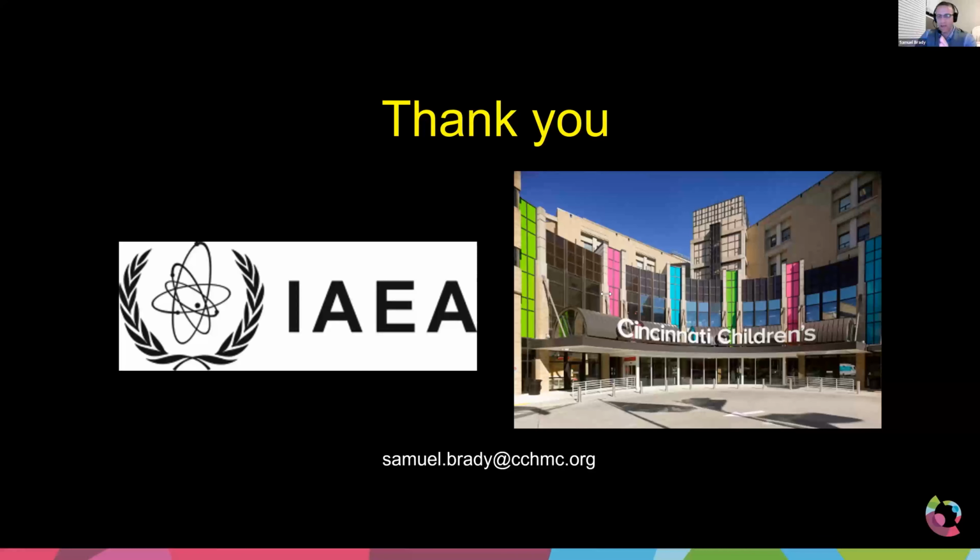And then you'll add whatever kernels you want to it, bone, lung, whatever. For bone, for example, you might want a thinner slice so you get better resolution in the Z-axis. Will the images look maybe a little noisier? Maybe. A 5 millimeter soft tissue and a 5 millimeter bone image, the bone image is probably going to look pretty good, but at 5 millimeters you're getting a lot of averaging. If you cut those thinner, you'll be able to see the detail in the Z-axis more finely, but because they're thinner, they're going to have a little more noise. It actually works out a little because the dose is set a little higher for the soft tissue versus the noise for the bone. So I would always default to the soft tissue.